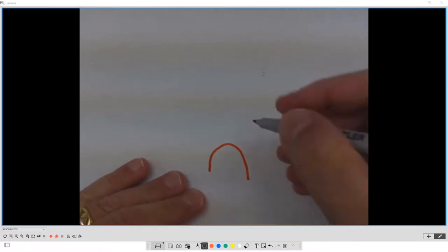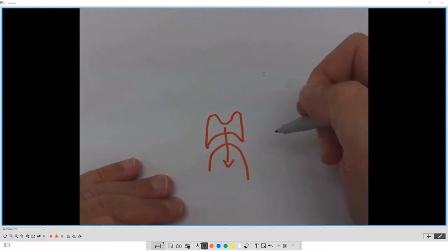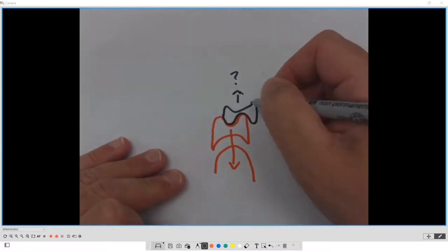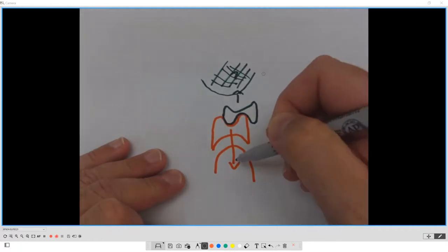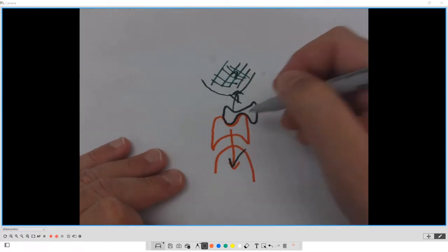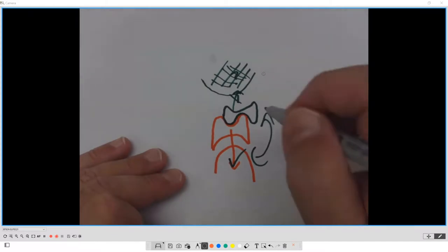Now, here's my beef. And I'm about to get extremely, extremely controversial. You have a lower ridge. The school tells us that we have to put that lower tooth directly over top of the lower ridge or you fail. Now, the upper denture tooth has to follow. So it follows suit here because we have nowhere else to put it. It makes absolutely no consideration of how the upper tooth is resting on the bone structure. We've let the lower determine it, thinking that we're helping for stability. But remember, the upper and lower have to work together, don't they? So now if it's working for the bottom, but it doesn't work together, it's going to mess up anyway. This is my fundamental concern.